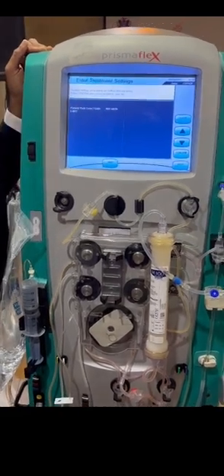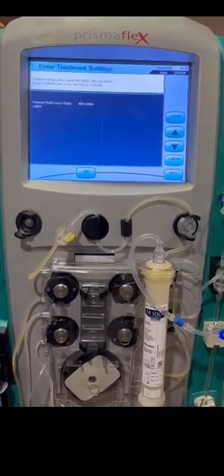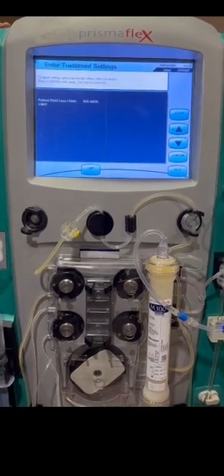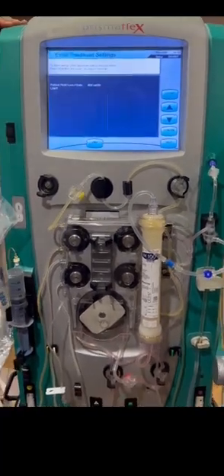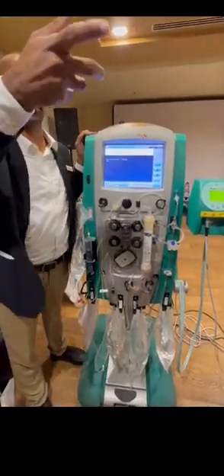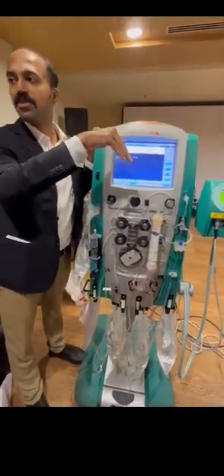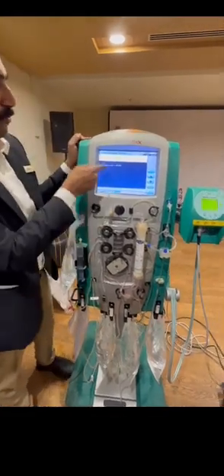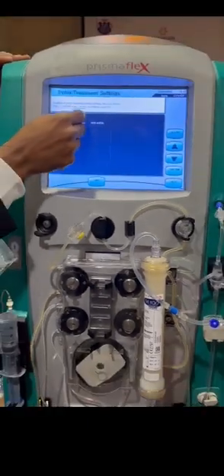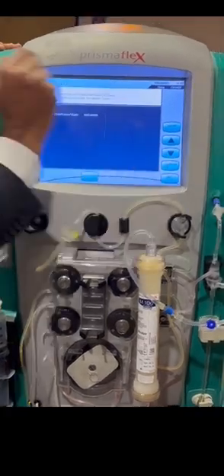So in our HD machine, suppose the UF is not removed, when will we come to know? Once the patient is going, they will say so, only then will we come to know their fluid is not removed. But here, because the patient is in the ICU, we have to check. There we are not giving any replacement, only the dialysis, nothing is going into the patient. Maybe the negative pressure goes into the patient, but here we are giving a replacement into the patient. So for that, by default we set this 400 ml per 3 hours. Okay, if I set 0, that will give alarms. Okay, got it? So I am confirming that.